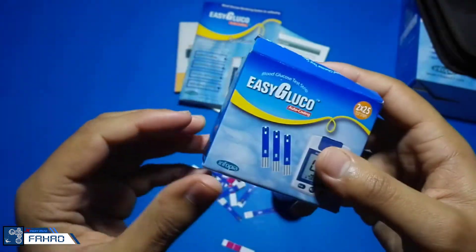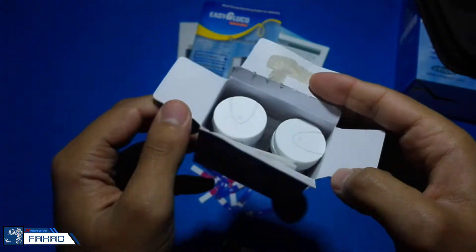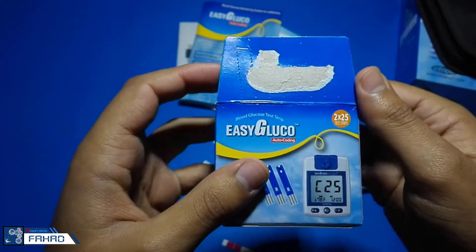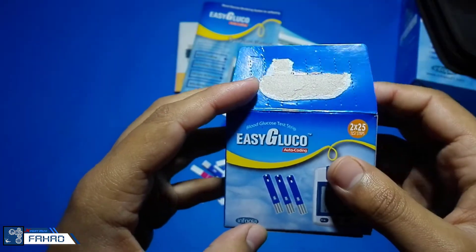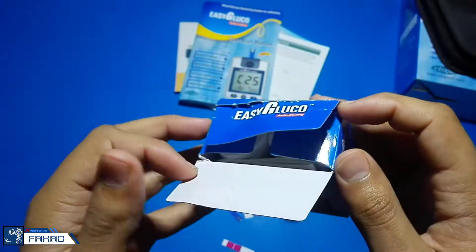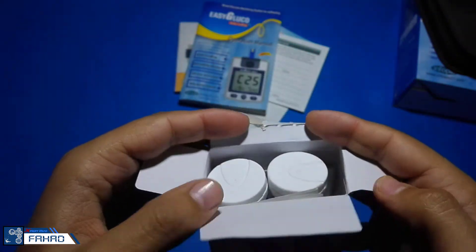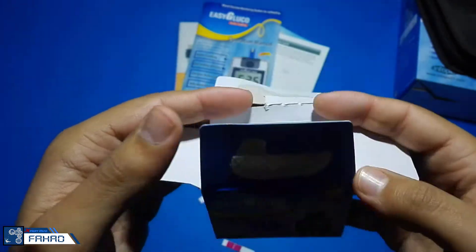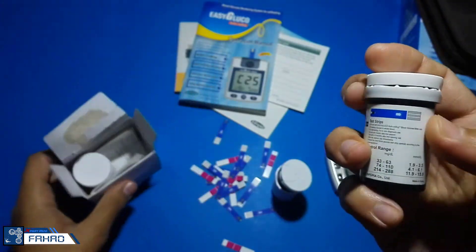I also got some extra strips for nearly 10 bucks, because I did not think that strips would also come with this glucose meter. They are the same strips — as you can see, the code on both is C25.